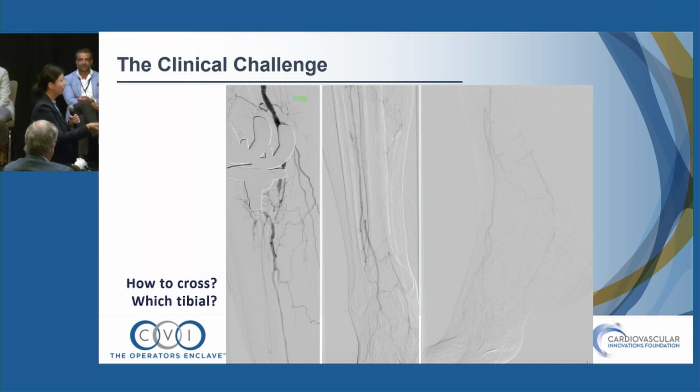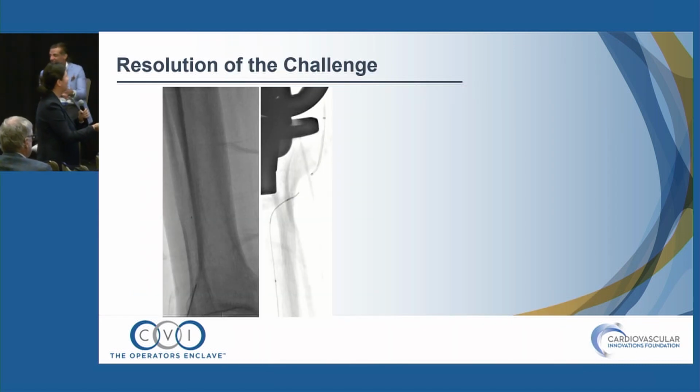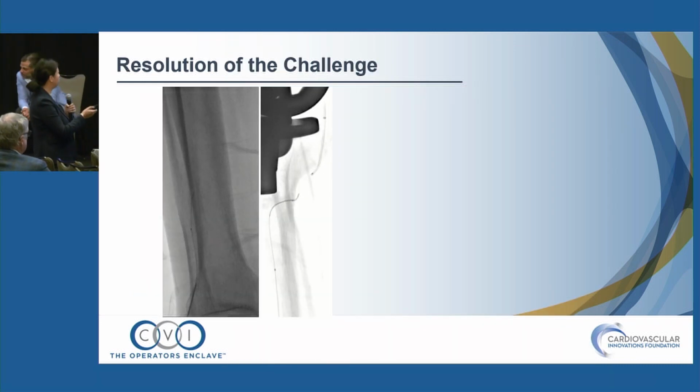All right. So all great points. Just to keep us on track here, I went antegrade first. Unfortunately, it was a very ambiguous reconstitution in the distal segment, so I switched quickly to retrograde. To Shirley's point, I upfront prep all CLTI patients in terms of their foot so that we can just open the drape and go retrograde quickly.